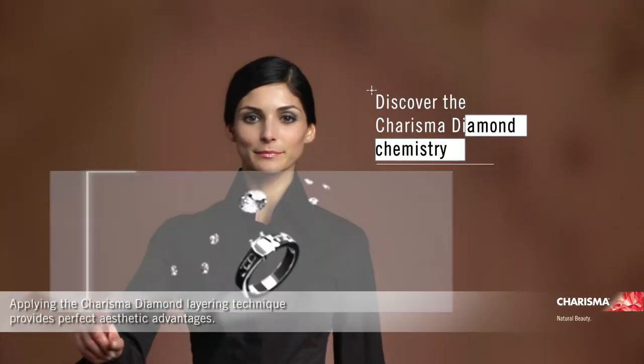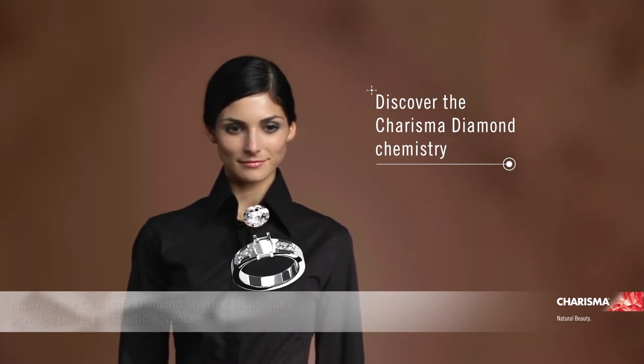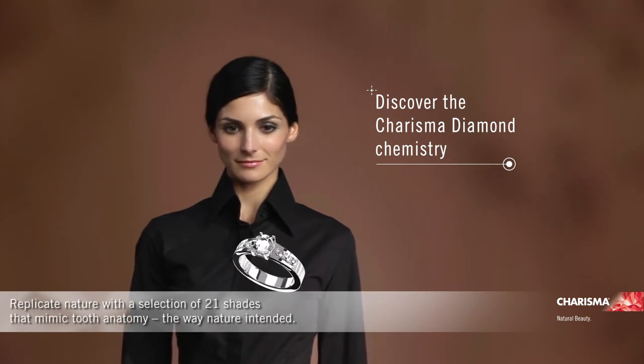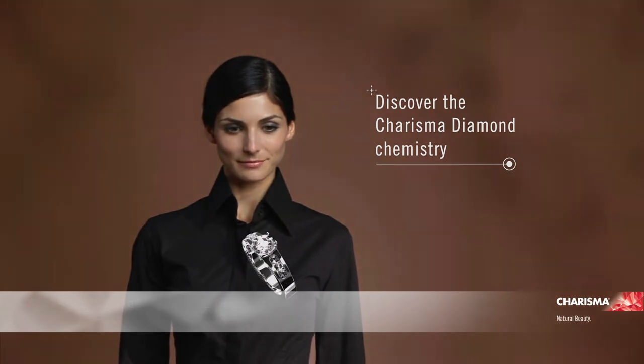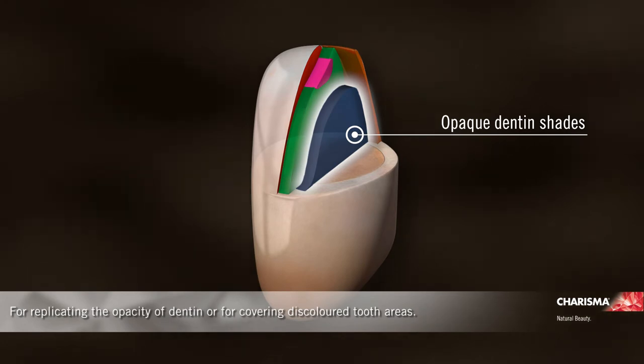Applying the Charisma Diamond layering technique provides perfect aesthetic advantages. Replicate nature with a selection of 21 shades that mimic tooth anatomy the way nature intended — for replicating the opacity of dentin or for covering discoloured tooth areas.